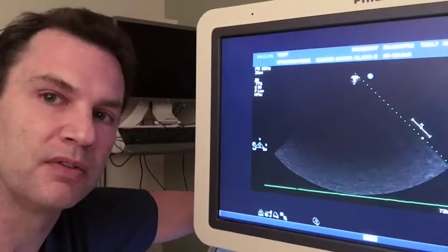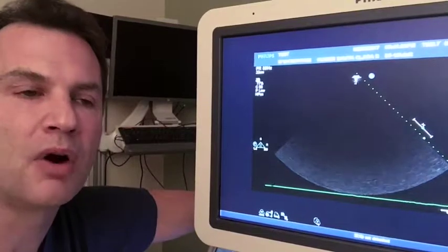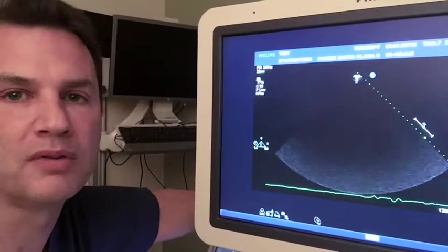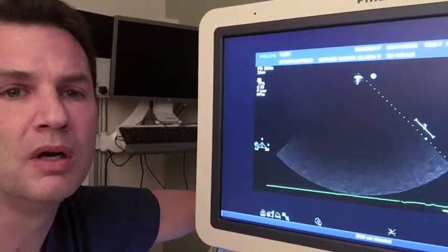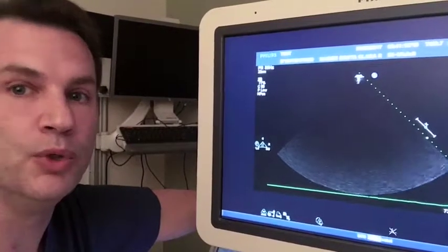This is what's necessary. The ones that have medical challenges, or heart transplants or left ventricular assist devices, are going to be one-offs or less often. And you should ask your physicians at your practice what it is that you need to do.